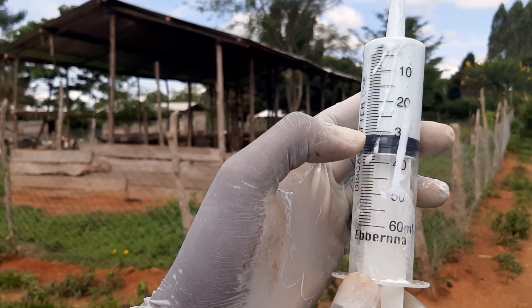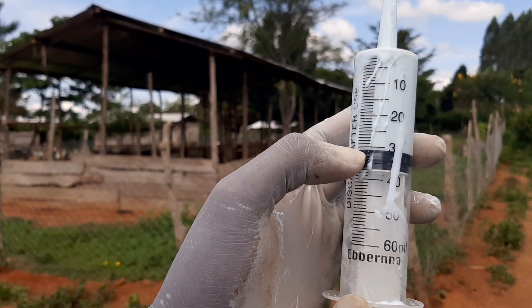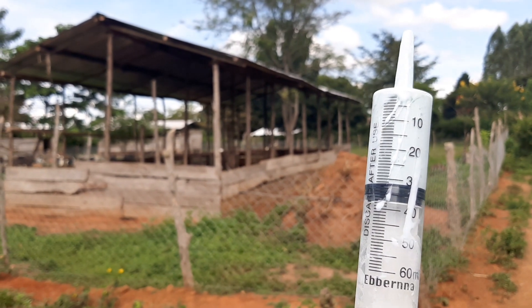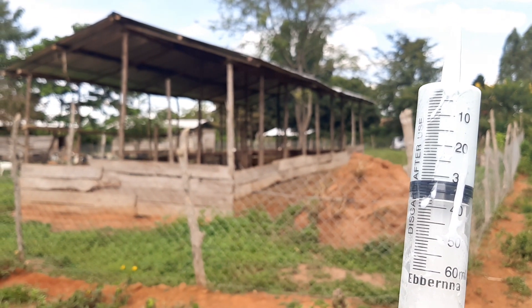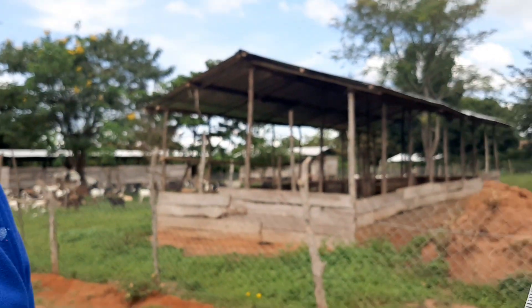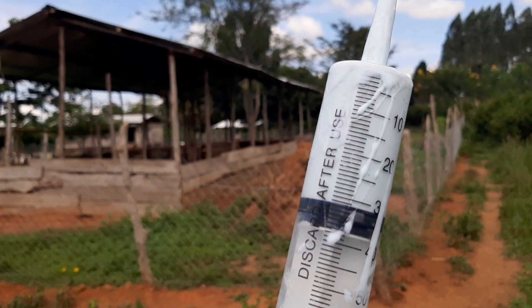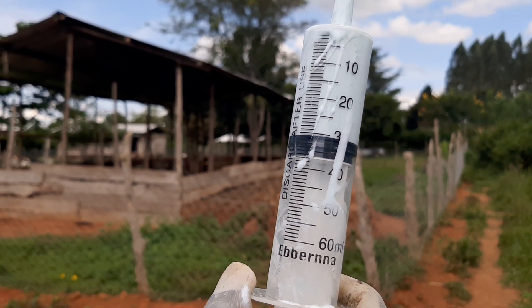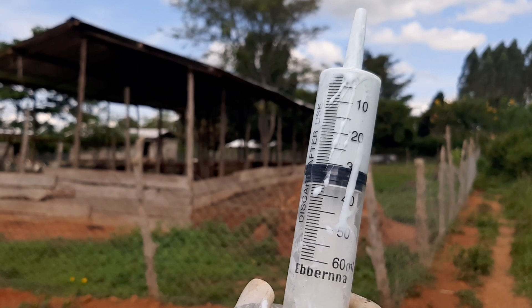This mark — you are taking it above it. You are not giving 30, you are giving 30.1. You are giving 31. It should stop here at 30. That black mark should stop at the mark.